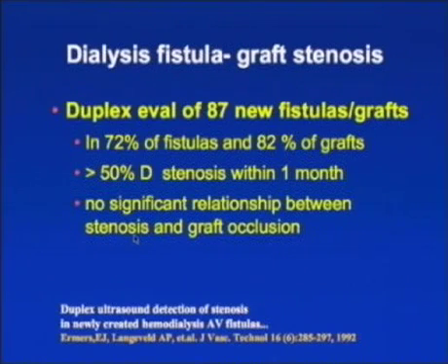So the fact that a number of these patients have 50% or greater stenosis doesn't exactly correlate to difficulties with perfusion. In fact, it's quite common to see this in anyone that has a graft longer than a few months.